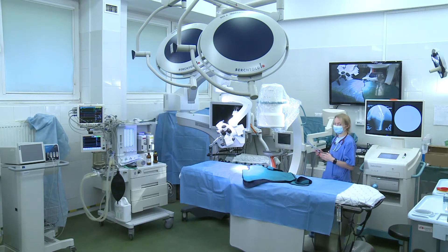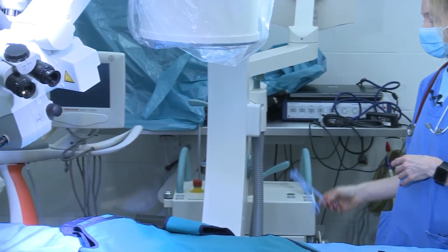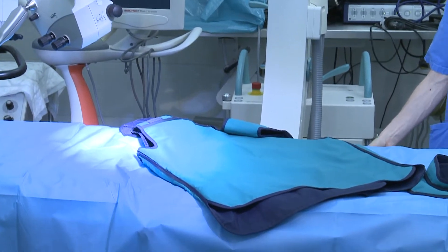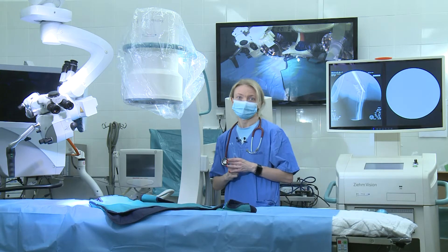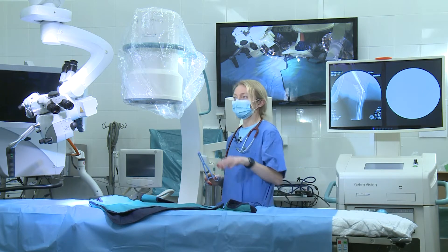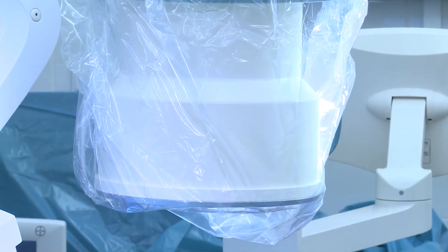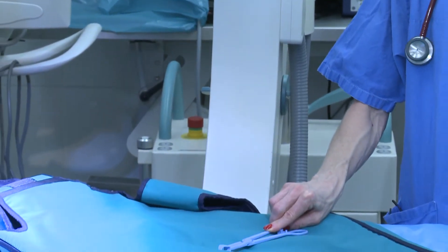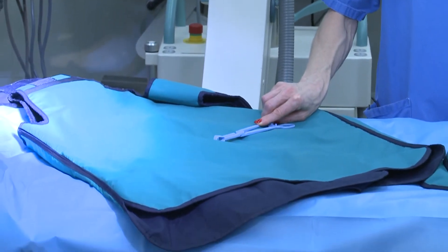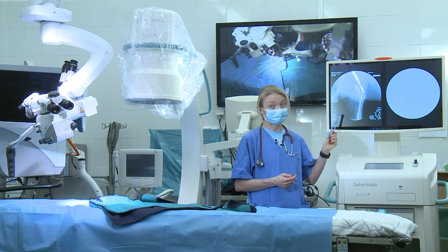The equipment which you see in front of me looks like a half moon or like a sea arm — we call it a C-arm. Basically, this is what we call the cathode which produces X-rays, and this is the receiver. If we put something in the middle, like our patient, we will obtain a view of what is inside our patient.